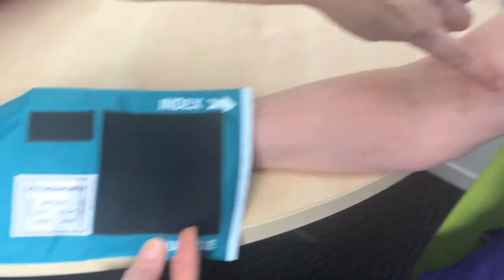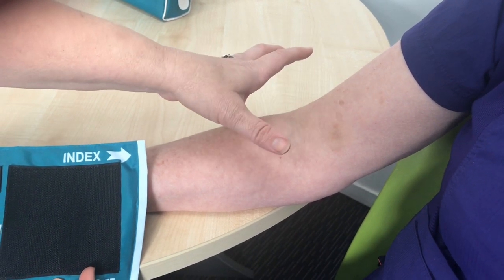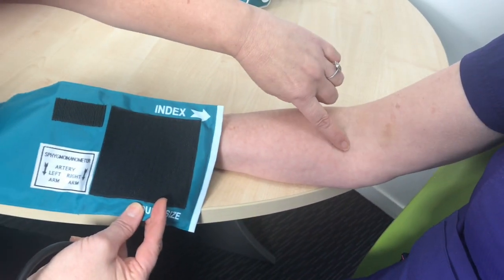Over here on the arm you have the brachial artery that runs down here. We're doing it on the right arm, so we're going to line that arrow up to the brachial artery along here.